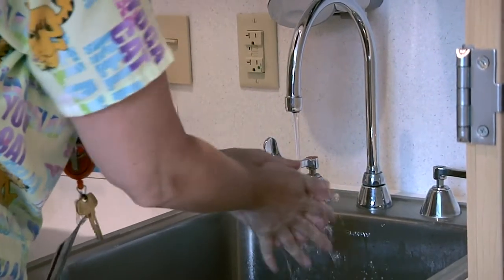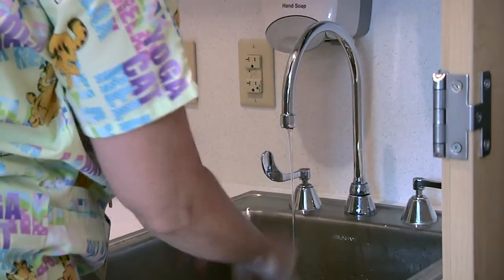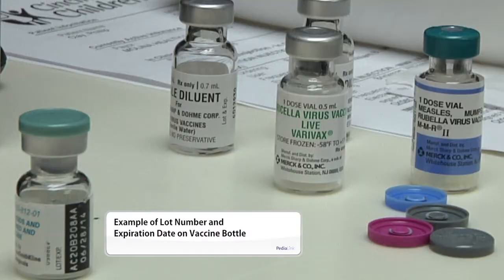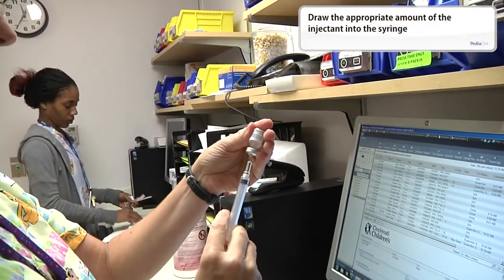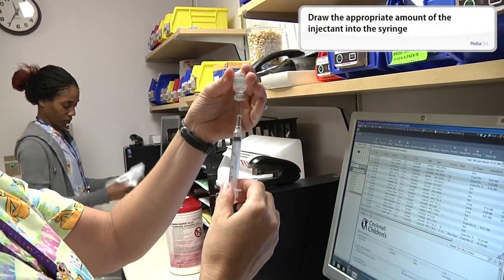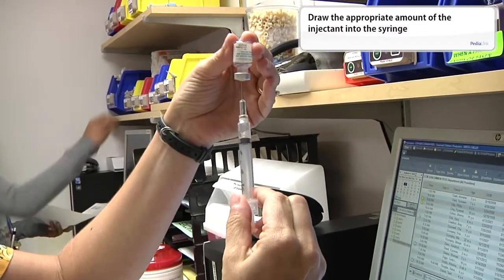As with any procedure, practice good hand hygiene and utilize universal precautions. If giving an immunization, verify the lot number and enter it appropriately into the medical record. Next, draw the medication from the vial. You may do this with an 18 gauge blunt needle or the needle you will use for the injection.